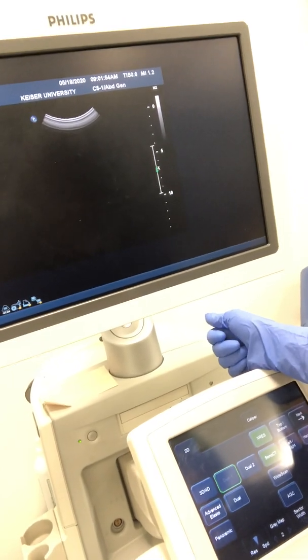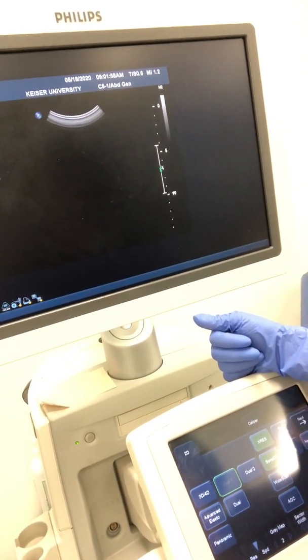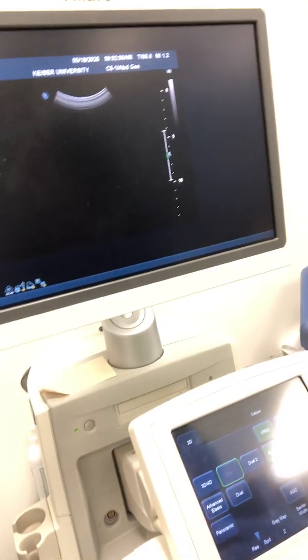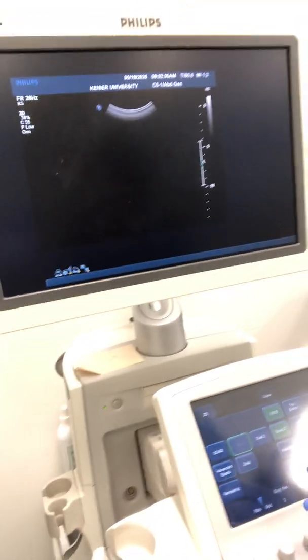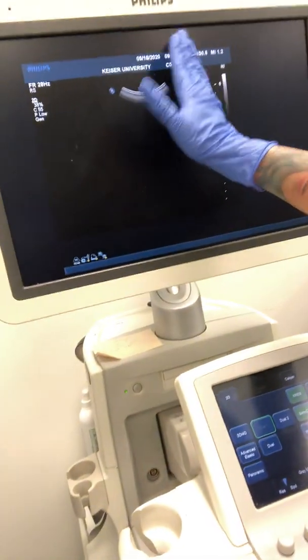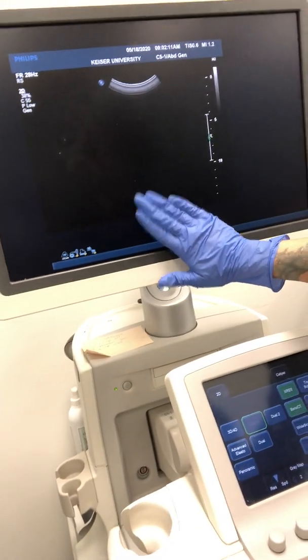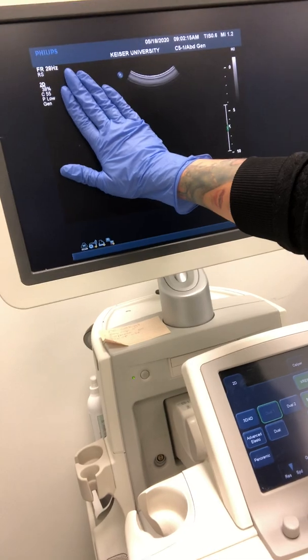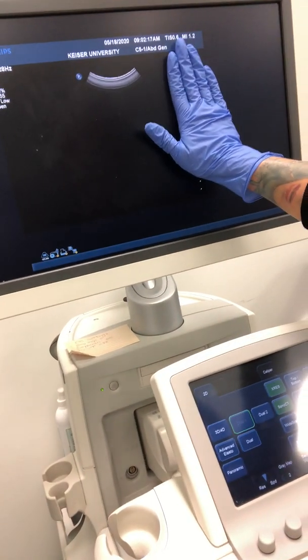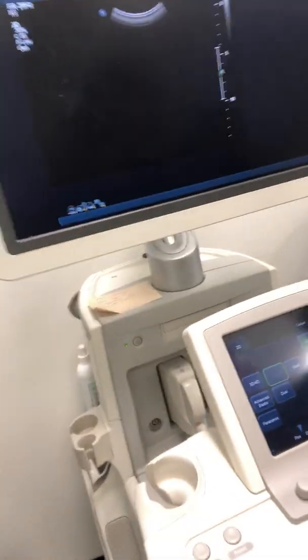If you turn the notch and essentially make it point towards the patient's inferior aspect or towards their left, your screen will be backwards, which is something we don't want because it's going to demonstrate that the normal anatomy is essentially backwards. So again, if we're going from an anterior approach, this is always going to be anterior to posterior, and then the left-hand side will either be superior or the patient's right, and the right-hand side of the screen will be inferior or the patient's left.